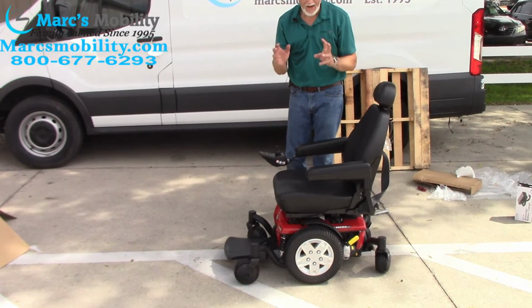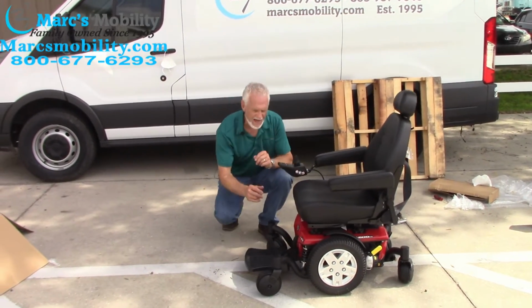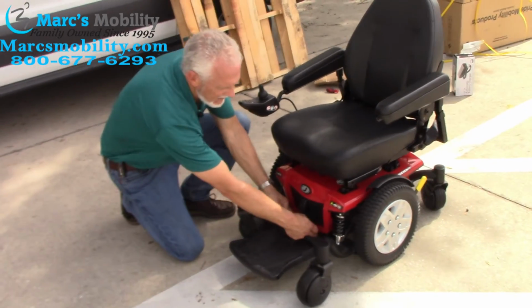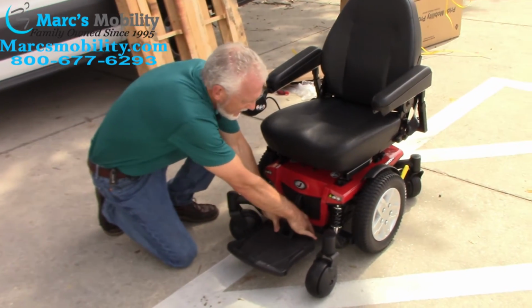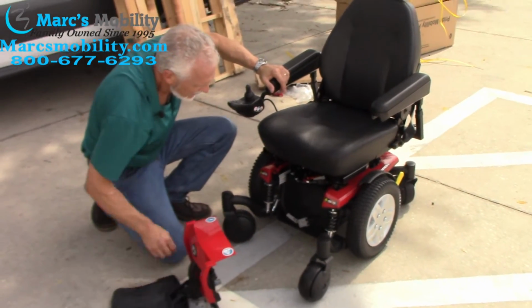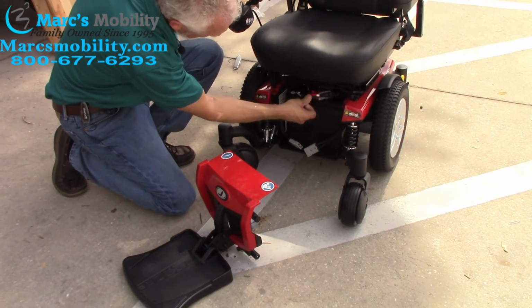All right, so we have the joystick on and we have no power. So you have to connect the batteries. When they ship these chairs, they disconnect the battery. So now the last thing you will do, you will take the front cover off. There's 2 levers up front. You squeeze them together and then you can raise the whole thing out of the way. There's 2 cables here.